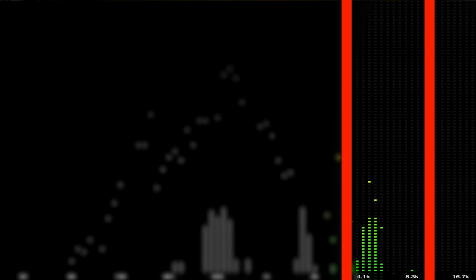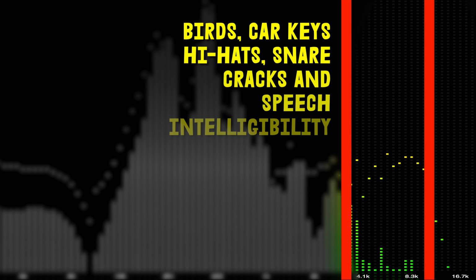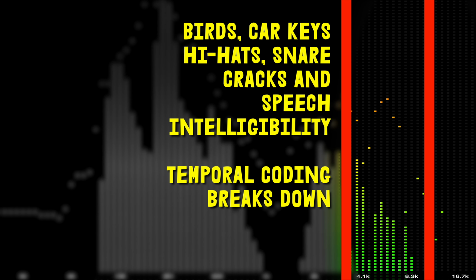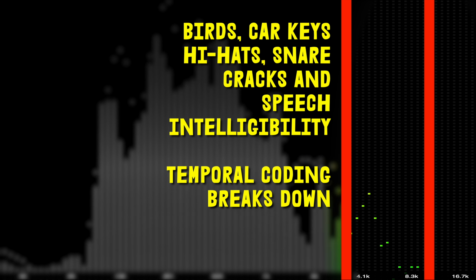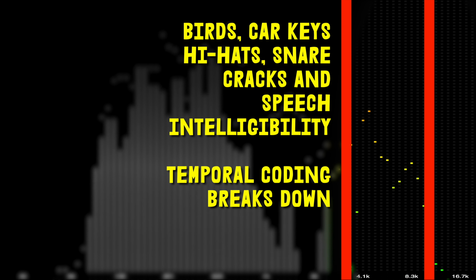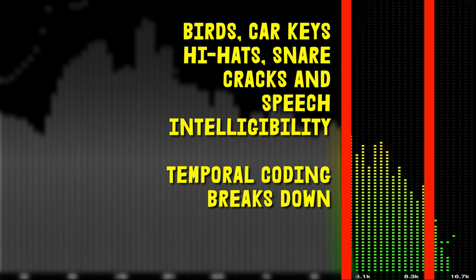But check this out. Sister Susie sat on a thistle. Sibilant sounds like S's and T's are where a lot of speech intelligibility comes from. Those frequencies sit roughly between about 4 and 8K, which is also where the snap of a snare drum comes from. Those frequencies make the keys in my hand tingle instead of clang. And since they're way up there above 4K, I don't really care if they're exactly the right pitch because, hey, everybody's JND is super forgiving of such inaccuracies up in that range. And it would just seem that my brain loves those sounds. They're what get me excited about slapping my processor on my head in the morning.